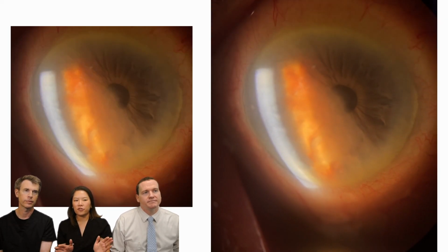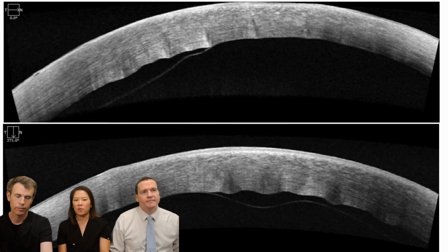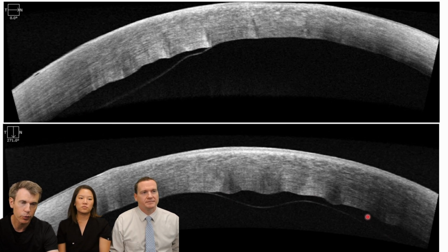But if you have peripheral edema, you have to remember that's still the patient's not so great endothelium that is out there, and eventually the better cells will populate that area. That takes a while to resolve. And again, OCT, same image as you saw before, this detachment. We tend to judge this as another assessment of correct positioning, even though you already know this is clear, so it's correct, but the graft should curl this way towards the cornea, which sometimes makes it more difficult to attach because if there's a scroll here, it doesn't matter if you push back here, that scroll will prevent the graft from attaching.